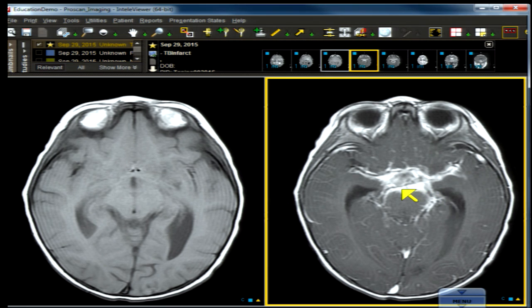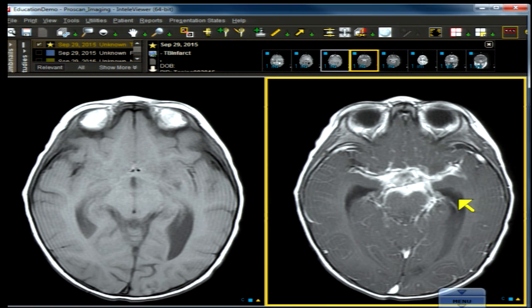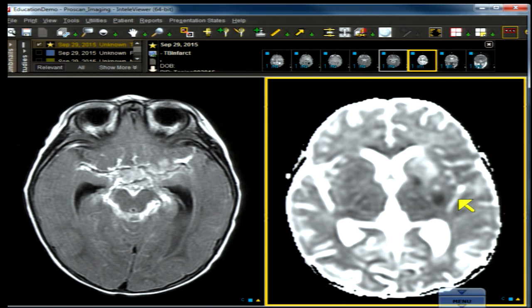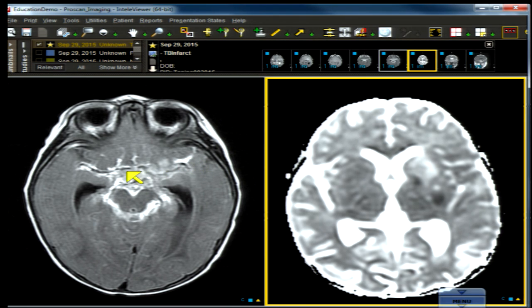There is an incredible amount of enhancement in the region of the circle of Willis and in the basal cisternal region, with dilatation of the temporal horns consistent with the diagnosis of obstructive hydrocephalus. This patient with a high fever is sick — sick by virtue of the imaging analysis and sick by virtue of the history.